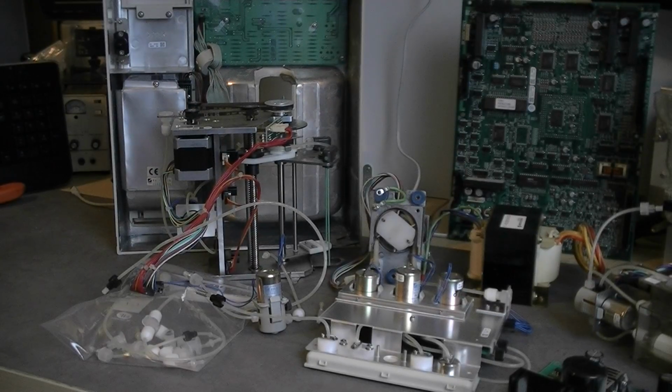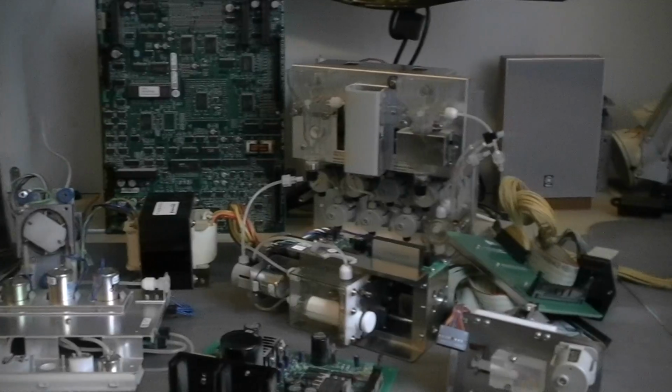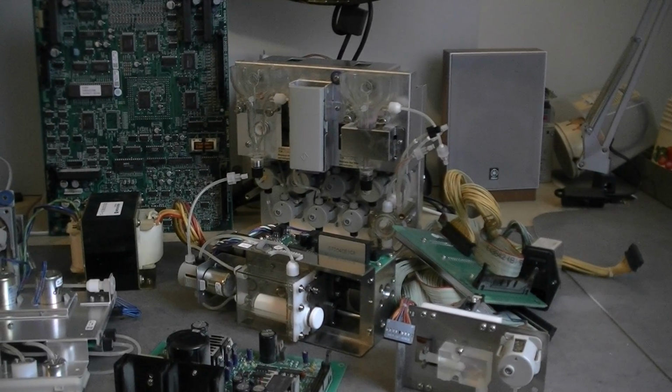Hi guys, a quick update about the blood analyzer. As you can see, it is more or less in parts. So in fact, when I started to remove the first module, the analyzer module here, I figured out that everything was quite quick to take apart and easy, just a few screws and connectors and tubes to disconnect. And in maybe 20 minutes, everything was apart.